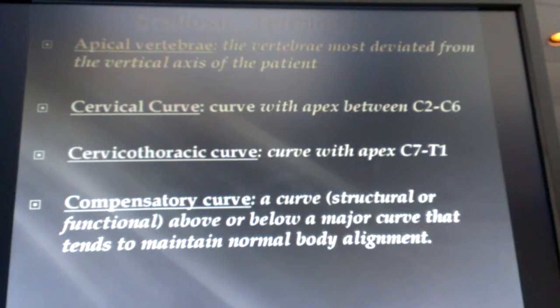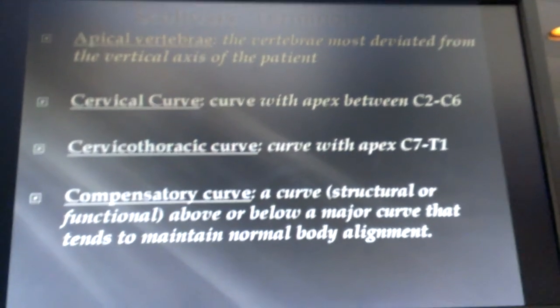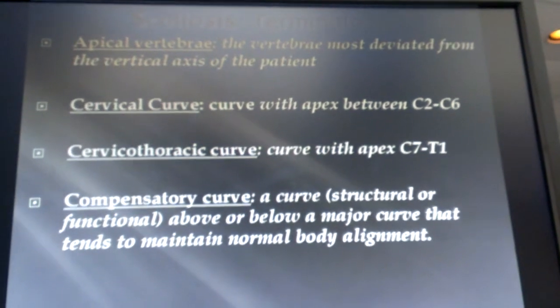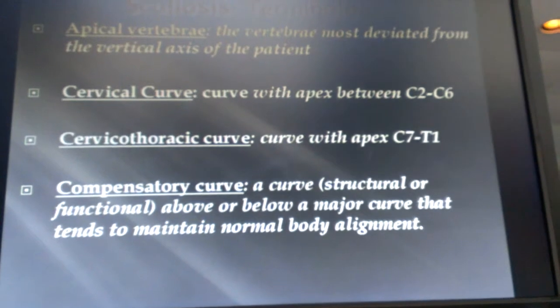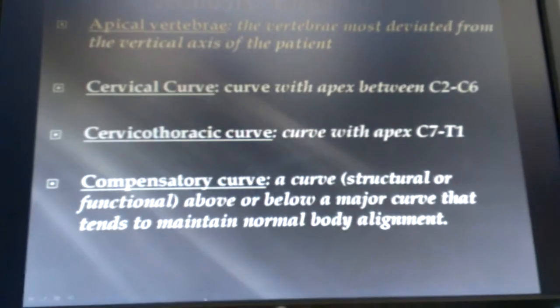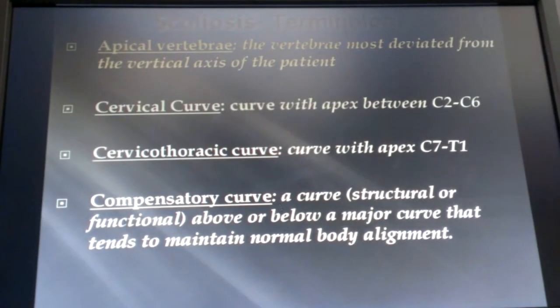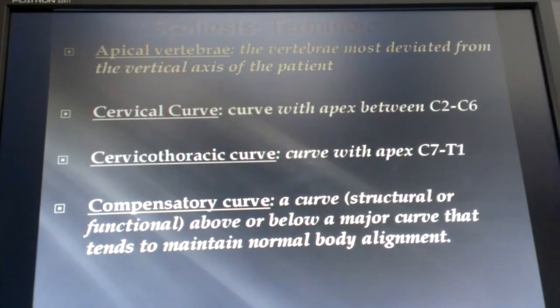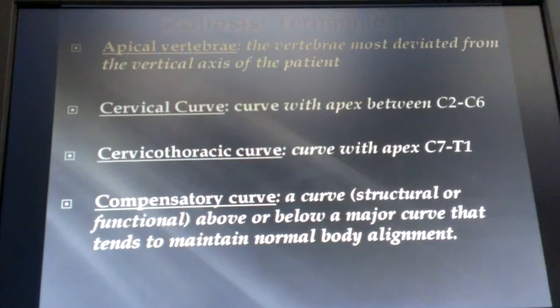But, you know, obviously if they've got hip dysplasia, if they've got a pes planus, if they've got a knee issue, right? Then what's significant there is that's the etiology. And so until that's addressed, you know, you're going to have these curvatures, whether they're primary or compensatory. What's important is to see whether or not, say in the case of the lumbar spine, compensation has occurred, where the pelvis is level, or that the shoulders are level, right?